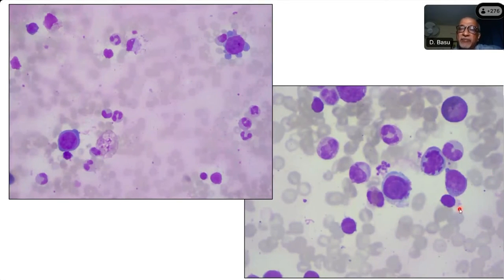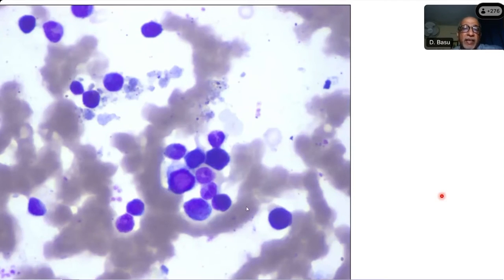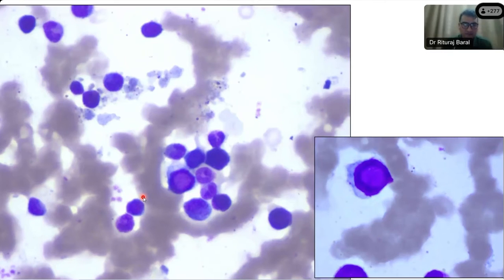The rest of it is again some lymphocytes and myeloid cells. Again another similar one. The cell in the center shows intranuclear inclusion, sir. Again, very prominent nucleolus. I've got it on the higher magnification, almost like a glassy intranuclear inclusion. Right. So what does that tell us?